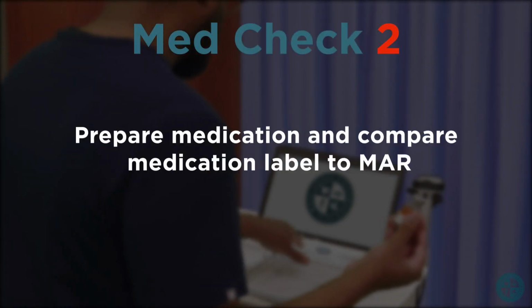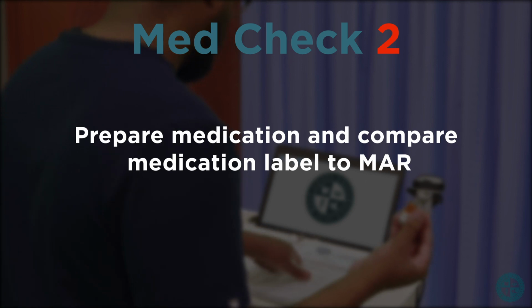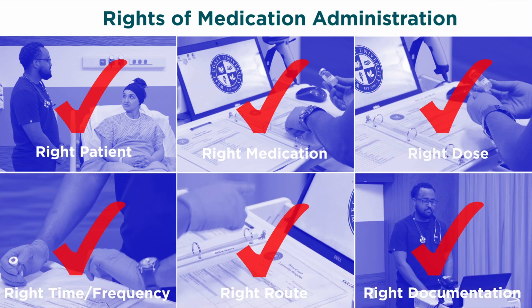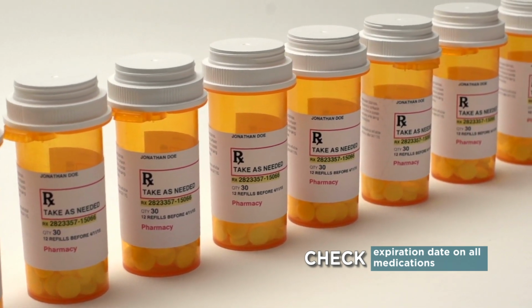Med check 2. Prepare medication and compare medication label to MAR. Perform the 6 rights of medication administration. Be sure to check expiration date on all medications.